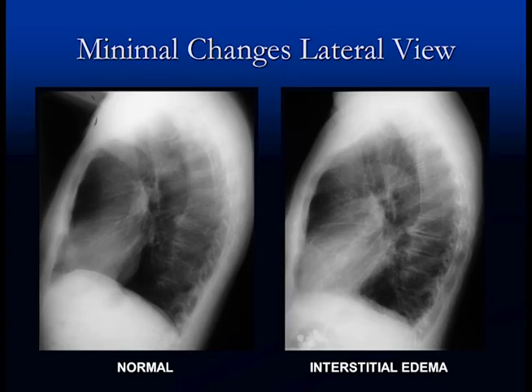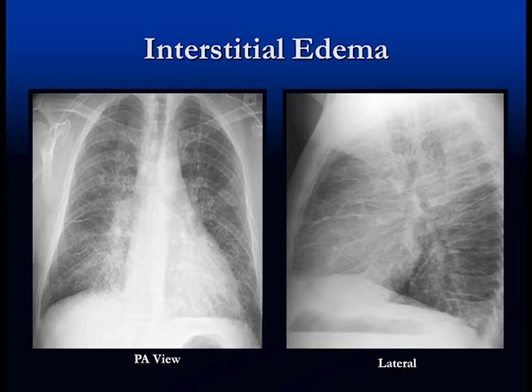Again, normal on the left and abnormal on the right — the same patient with interstitial pulmonary edema. There are way more lines, a sort of ground glass haziness, the hila are bigger, and the vessels are ill-defined. On the lateral view — normal on the left, abnormal on the right — there's thickening of the fissures, and the hila look bigger and smudged, ill-defined.